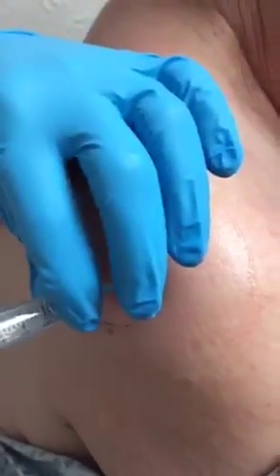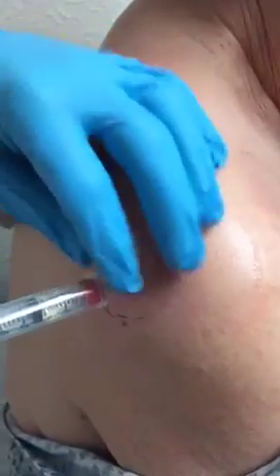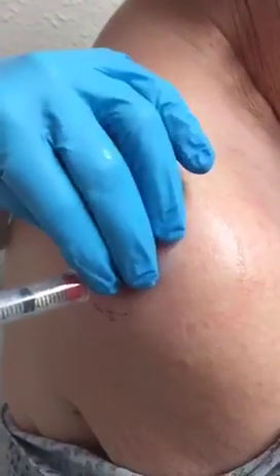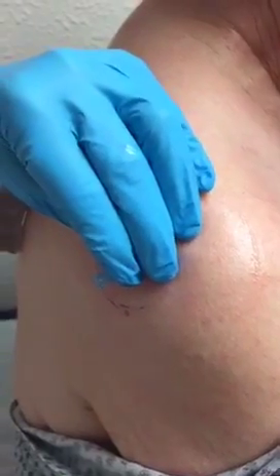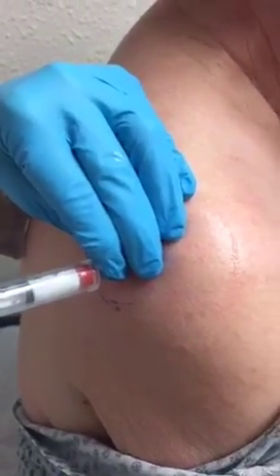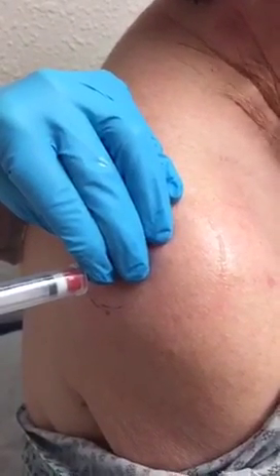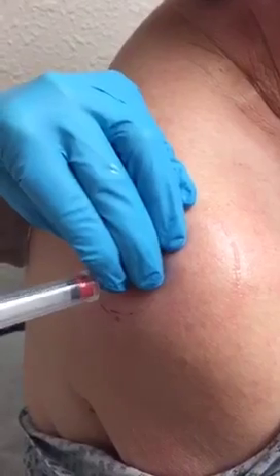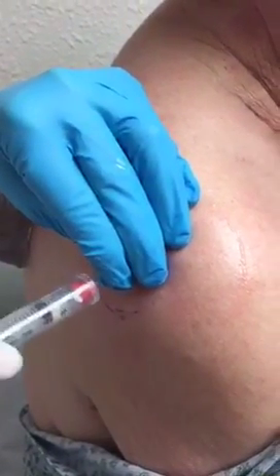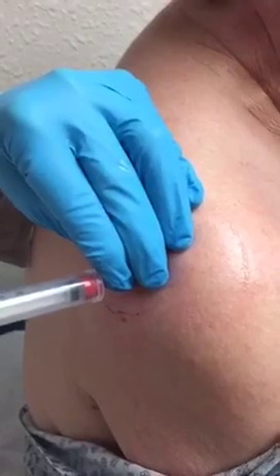All right, draw back to make sure there's not anything that shouldn't be there, and then give some medicine. And then you're not screaming or kicking. No? Do you feel it? You do feel it. Okay. How bad is it? It is pretty bad. Okay. She's pretty tough. If she's making that face, it hurt. It is hurt. Okay, let's get done as quickly as we can then. Yeah, she's pretty tough. Okay, that's the whole procedure.